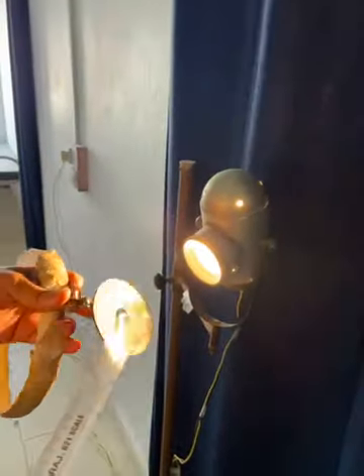Welcome to ENT student. Now we are discussing about the forehead mirror, which is a concave mirror. We are showing it here. It converges the light like this.